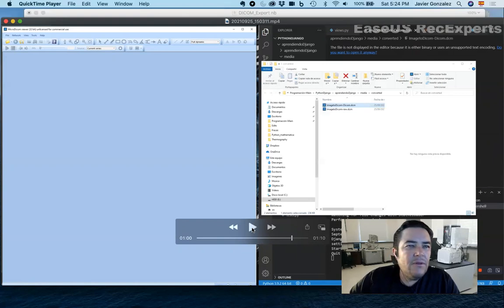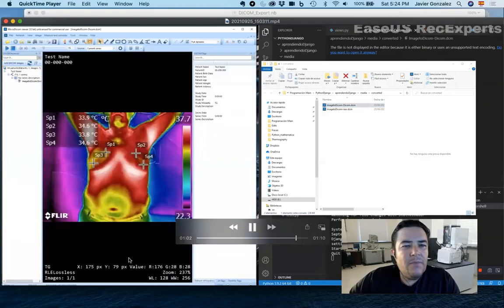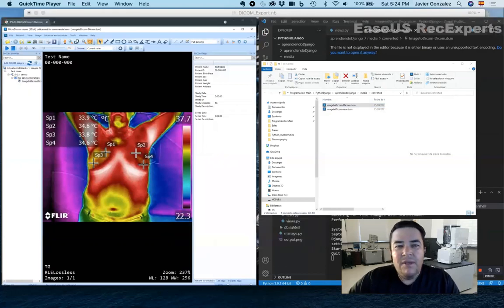This is actually a commercial DICOM viewer called MicroDicom. I did a video in Windows because MicroDicom only works on a Windows system, and I have a Mac. And now we can upload the DICOM file we generated, and you can look at it here. The thing is that this image is not a radiometric image. It's just the JPEG image, because this DICOM viewer doesn't know that we stored a temperature matrix in another frame of our DICOM file, right?